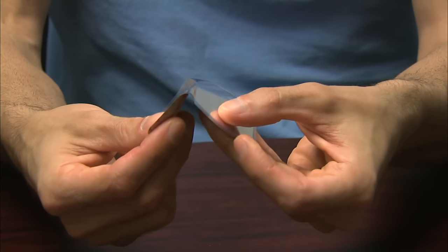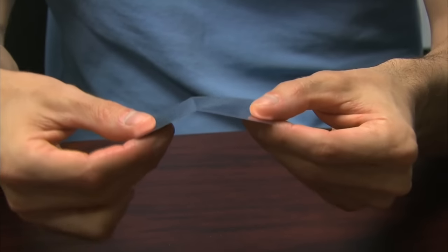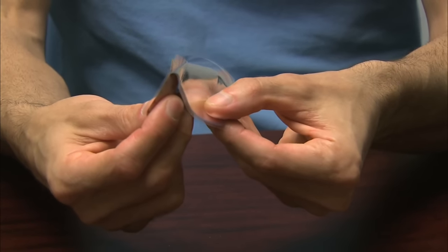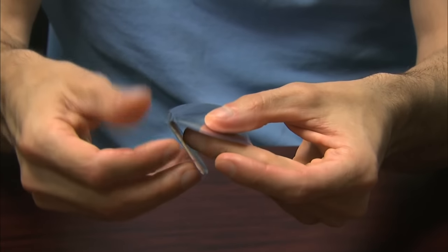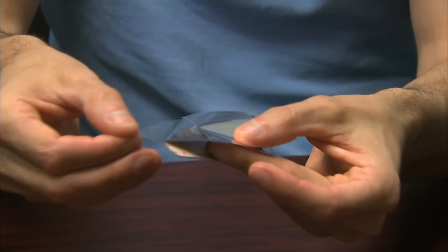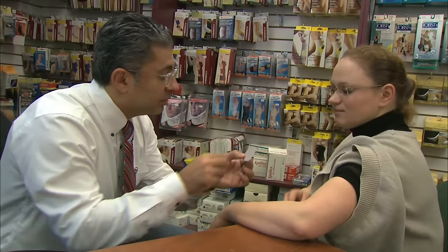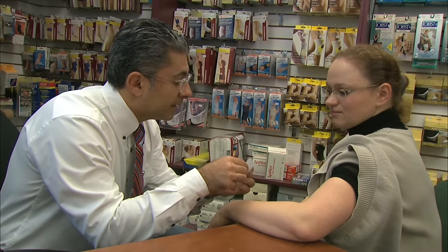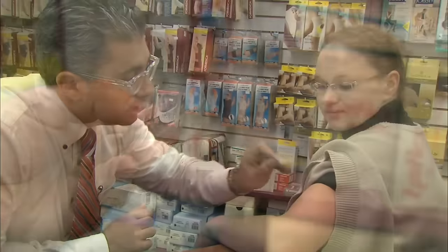Hold the patch with the removable protective liner facing you. The removable liner is the part you remove and discard when applying the patch. Start by gently bending the patch along the cut in the removable liner and slowly peel away one half of the liner to expose the sticky adhesive surface underneath. You must avoid touching the sticky adhesive surface with your fingers.